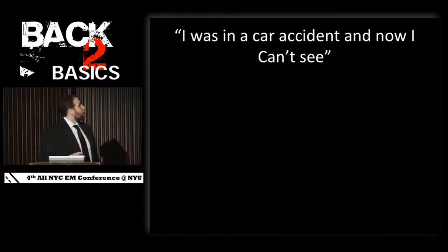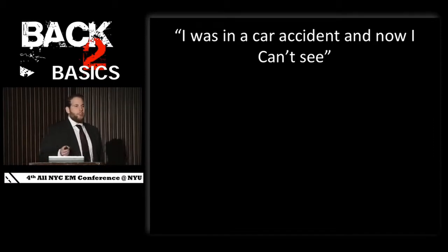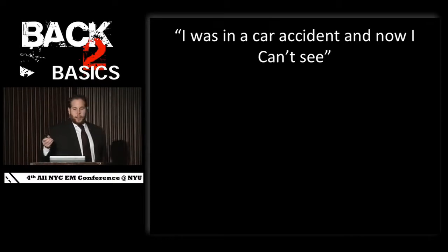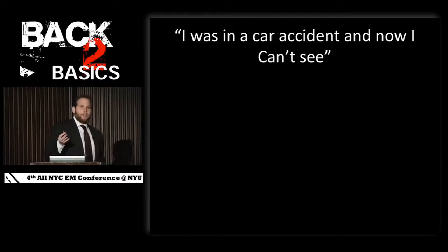So the next patient came to me. He was in a minor MVC earlier in the day. The airbag went off, but he felt fine. He went home. He didn't go to the hospital. But as the day progressed, he had worsening vision in his eye. So you look at the eye, there's no obvious signs of trauma. There's not a lot of swelling, but he does have some decreased visual acuity.